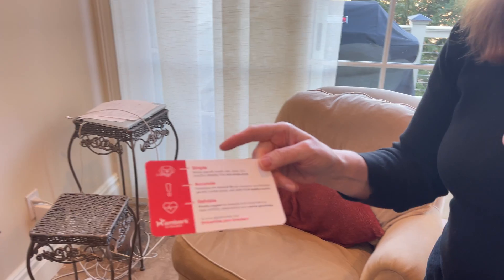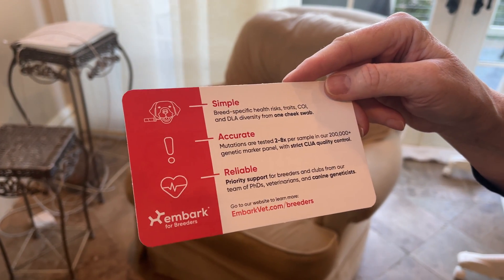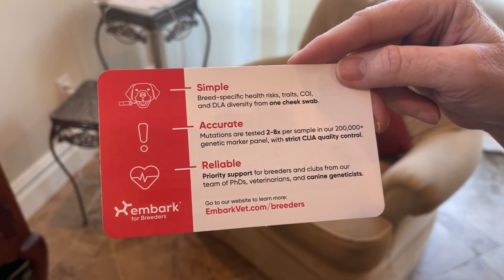Let's follow along with the instructions. They say it's simple: breed-specific health risks, traits, COI, and DLA diversity from one cheek swab.